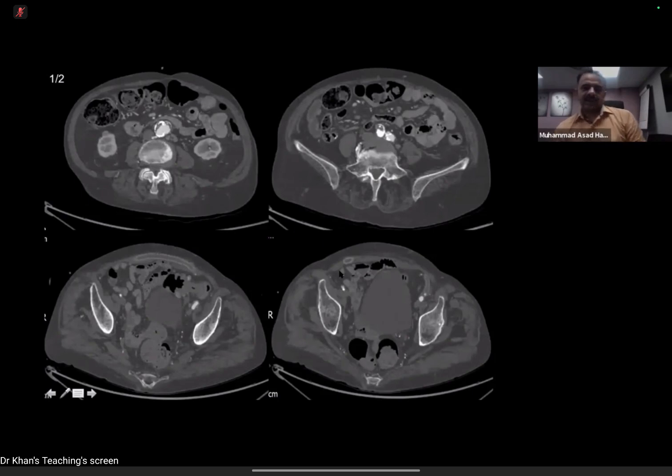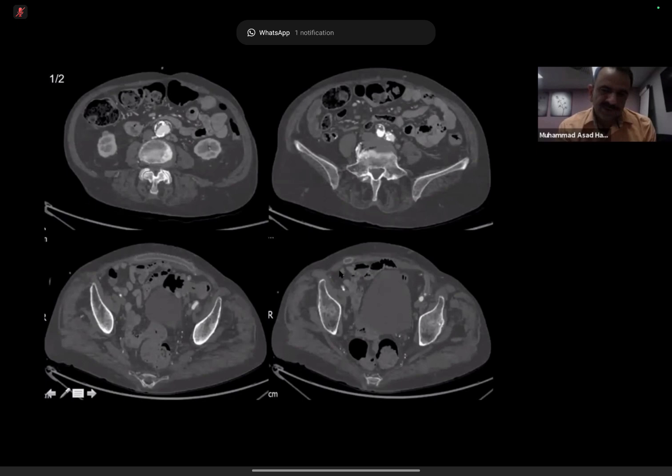It's not opacifying with any contrast. So this patient has had long-standing iliac artery occlusion. In order to save the limb, an iliac to femoral bypass surgery was previously performed, and she has now presented with an occluded graft, which is threatening her right lower limb. How can you help this patient?